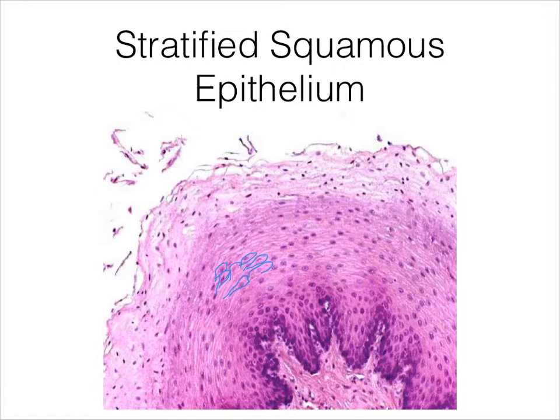Some of them, again, you're not going to be able to see the nuclei on because maybe it wasn't in the part that got sectioned. But if you look at the tissue overall, you can see that each of these cells is packed closely to the other cells, and by and large, most of them have nuclei, and it's very densely packed with very few fibers. We can tell that it's stratified, clearly, because there's lots of layers. That's not really a question.